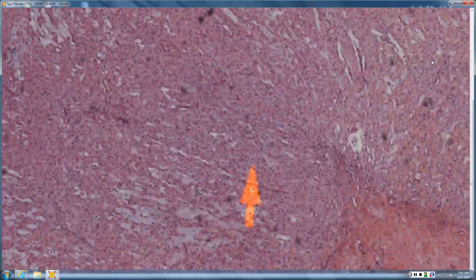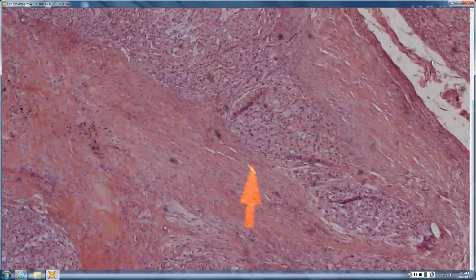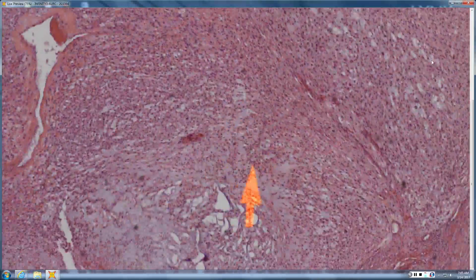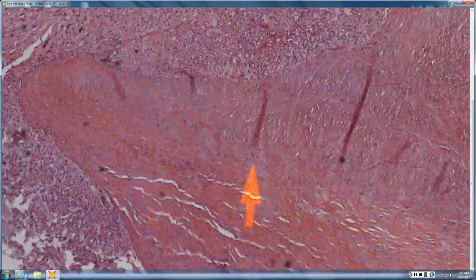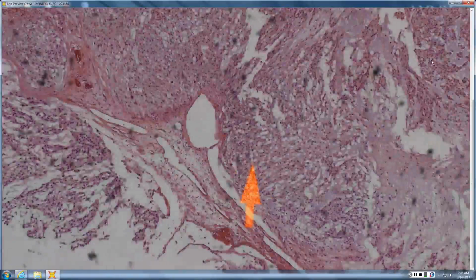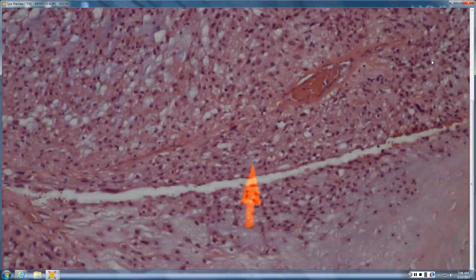So this really looks sulfated. It looks more cartilaginous. So you think, what kind of fibrous things are on a cartilaginous spectrum? Like an enchondroma. Enchondromas certainly are cartilaginous, but tend to occur in bone rather than skin.